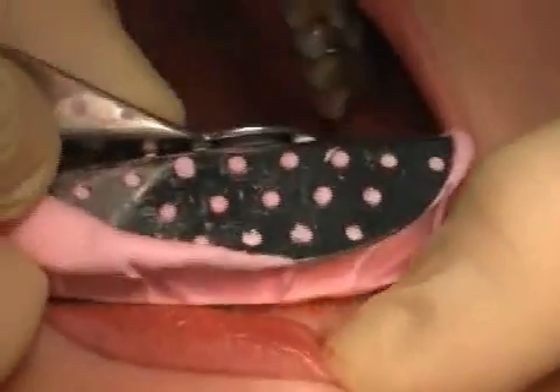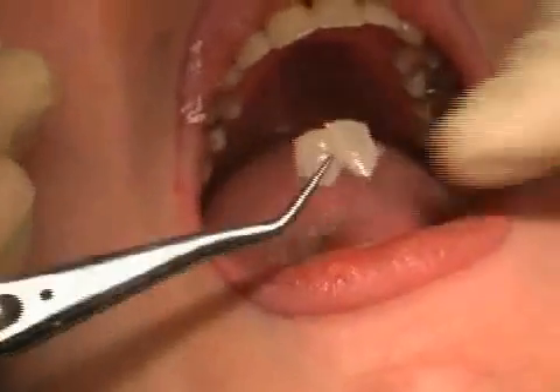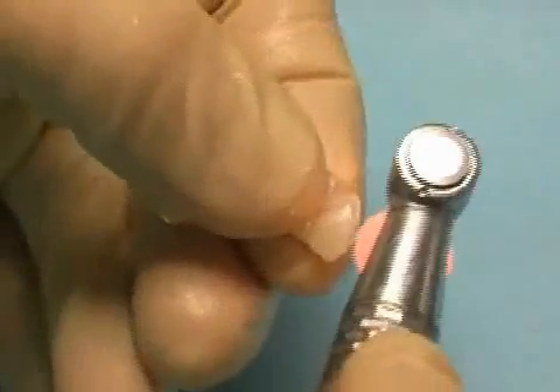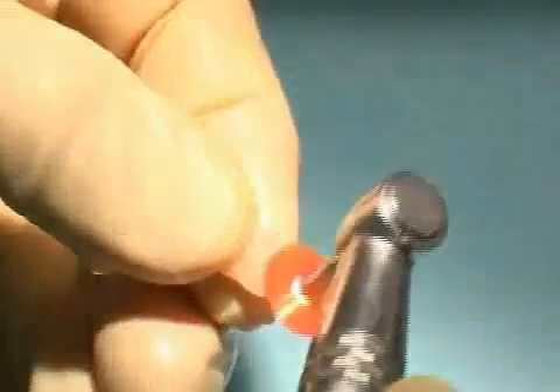After hardening, the impression is taken and the temporary veneers are removed from the impression. Now the protrusions are removed and the surfaces of the temporary prosthesis are polished. The temporary prosthesis is slowly given shape.